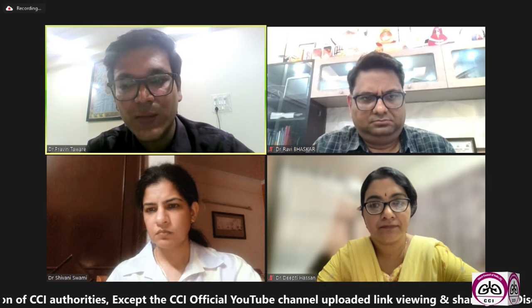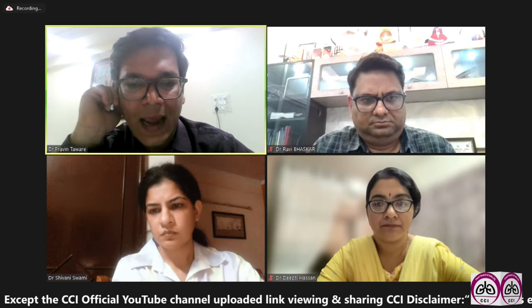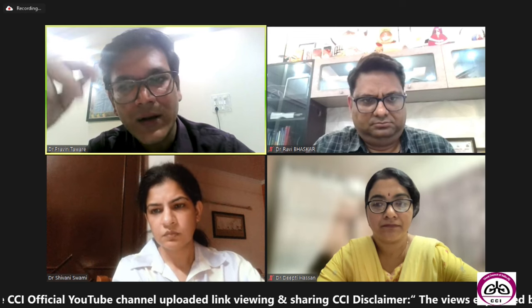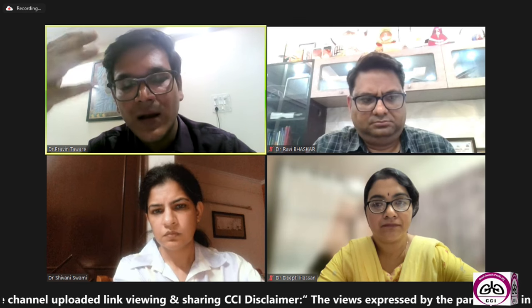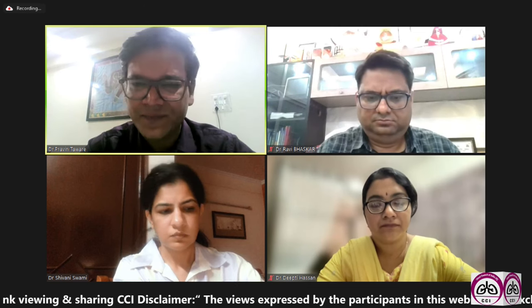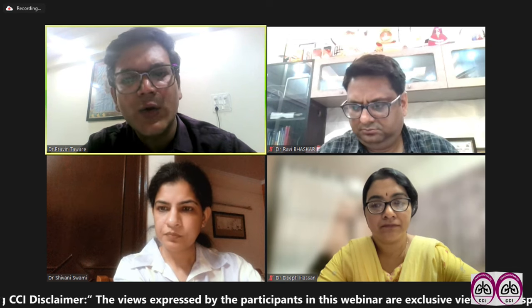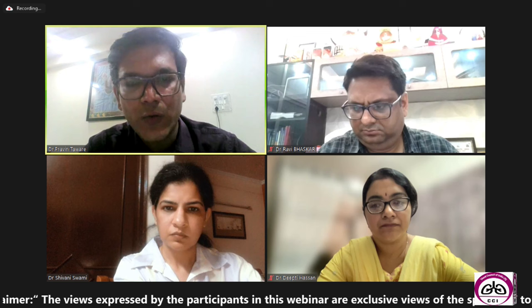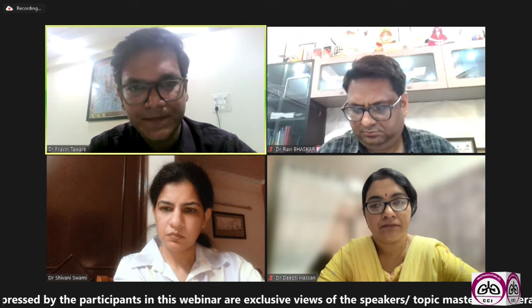So hospitals and healthcare facilities should preferably use a single use nebulization unit. And they should work on all these protocols, and whosoever is a healthcare worker looking after those patients, they should wear all protective gear, including mask, gloves, if possible cap and glasses. So these are the infection control policies I think we should follow when we give nebulization therapy in wards, in hospital or in ICUs.